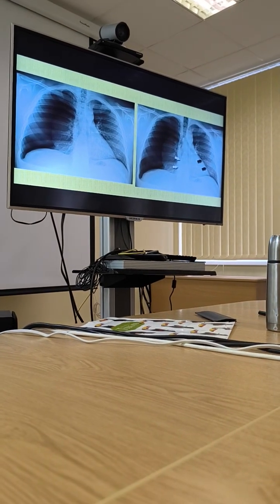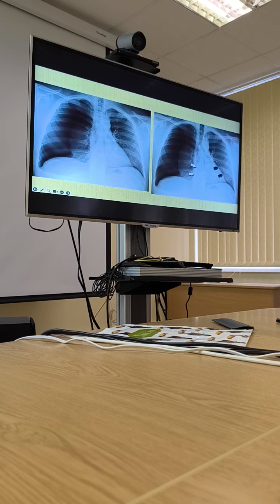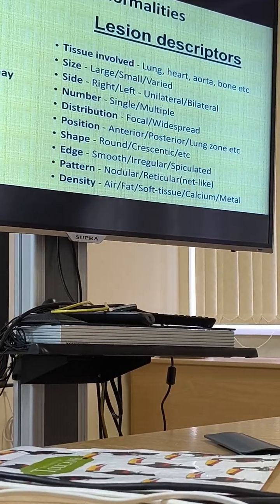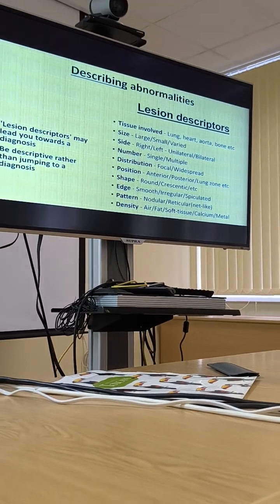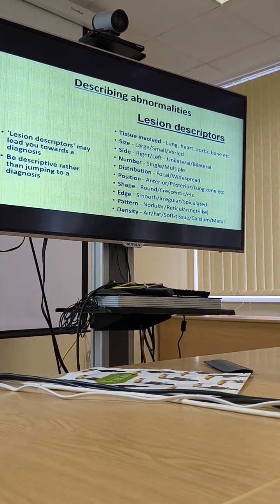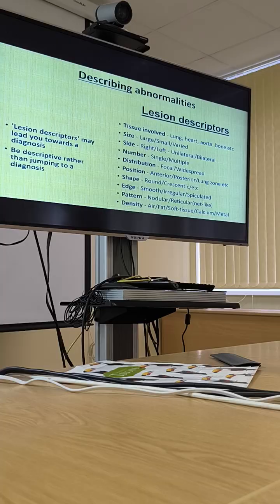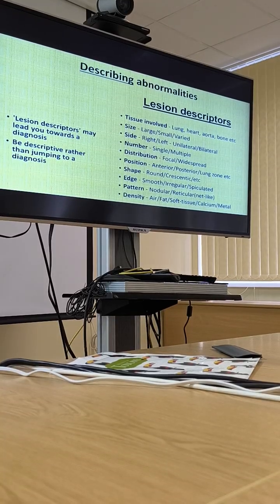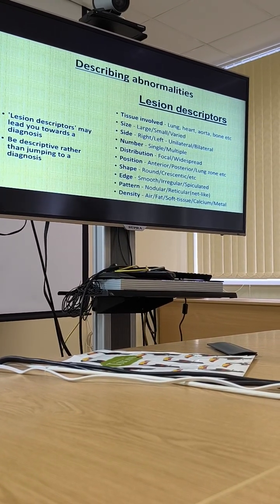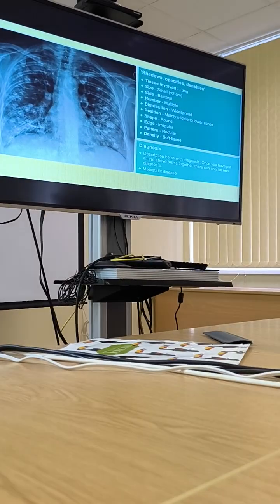If you have more experience, probably you will start with that thing, and that will make your work shorter. But this is easy, and it's okay to do it like this, because this is the scheme which is recommended in the English tradition. This is the lesion descriptors, and this is just a list. I don't like it because, for my Russian mind, it sounds just like a list, and the Russian scheme sounds to me like something very, very expressive. But if it is better for you, you can do it like this. There is an example of how you can use it, you can look for it.